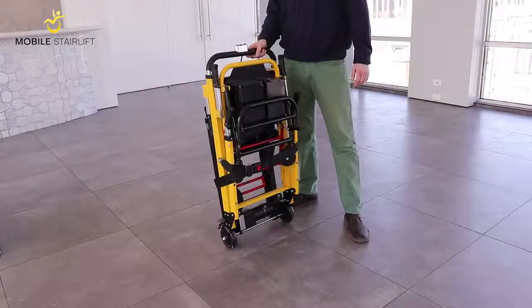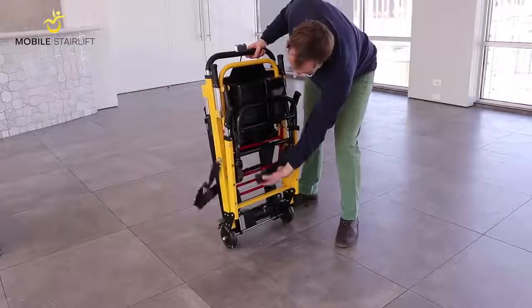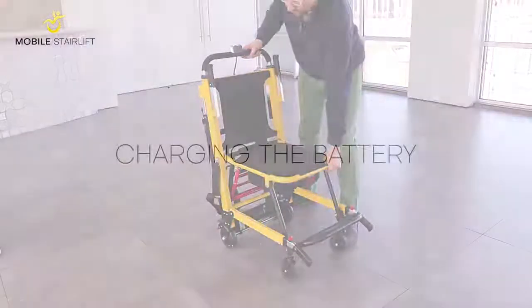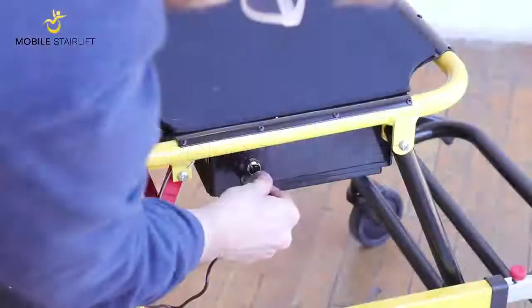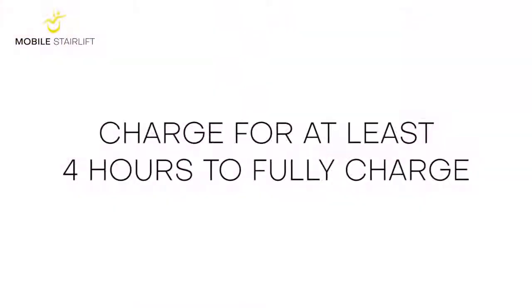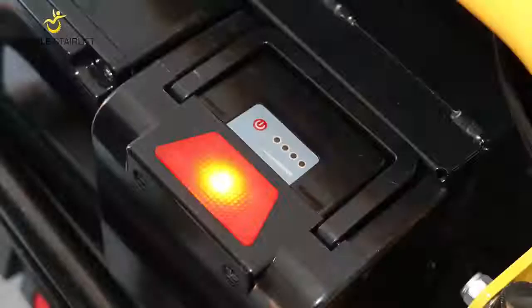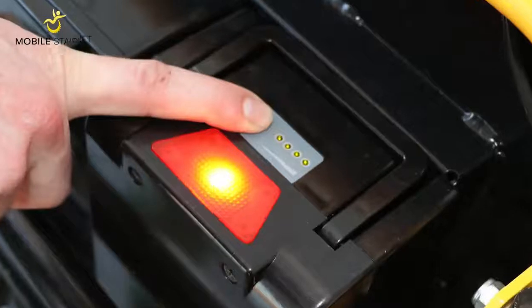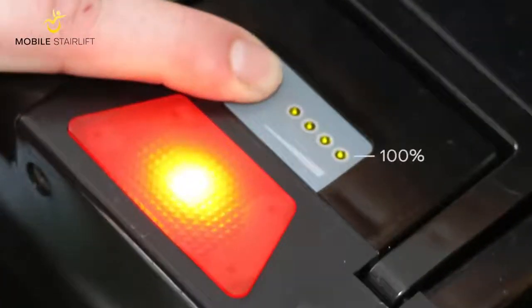Once you're ready to use the stair lift, unbuckle the seat belt, then fold the seat down until you feel it lock into place. Next, attach the battery charger to the charger port and plug in the adapter to the wall. Charge the battery for at least four hours to ensure that it is fully charged. You can check the battery's power level by pressing the red button next to the four lights on the battery.